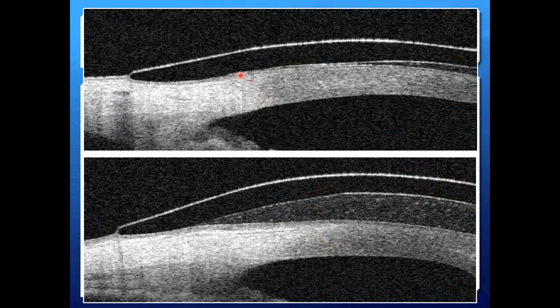Now here would be an example where we might have a very thin limbal clearance zone or vault through the peripheral cornea and limbus. By changing that angle, you increase the vault and create a much healthier lens to cornea relationship, or lens to surface relationship.